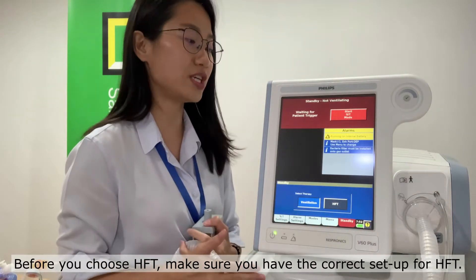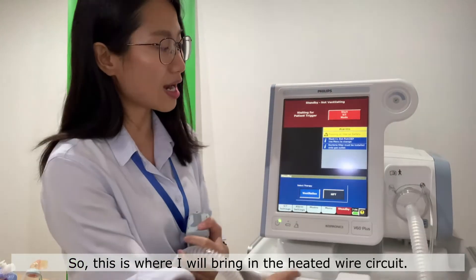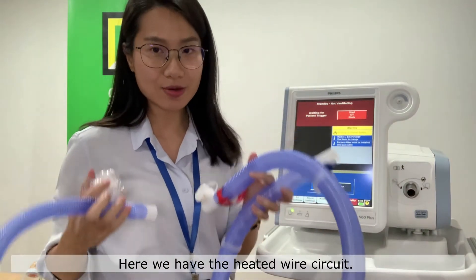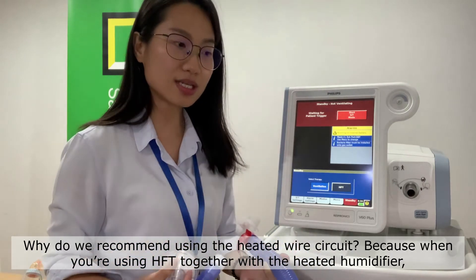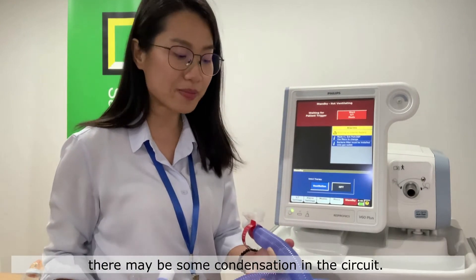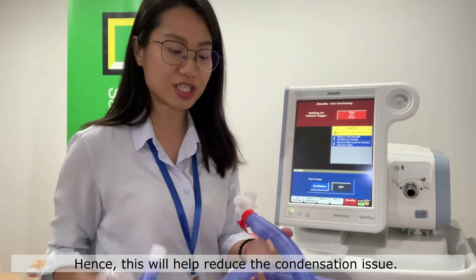Before you choose HFT, make sure you have the correct setup. This is where I will bring in the heated wire circuit. We recommend using the heated wire circuit because when you're using the machine's high flow therapy together with the heated humidifier, there might be some condensation in the circuit, and this will help reduce the condensation issue.